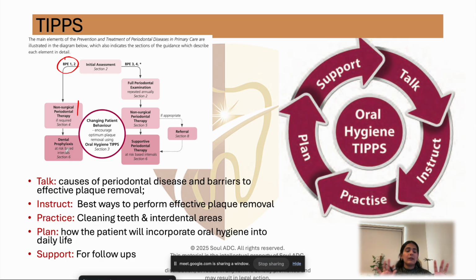So basically we are going to do checkup and clean for all the patients. We are going to do thorough debridement of the patient. Now when we were talking about your 3 and 4 and star, full perio examination, I hope you know now. 3 means only that section we are going to do your periodontal examination. Your 4 and star we were doing for your whole mouth, wherever it comes out in the box.